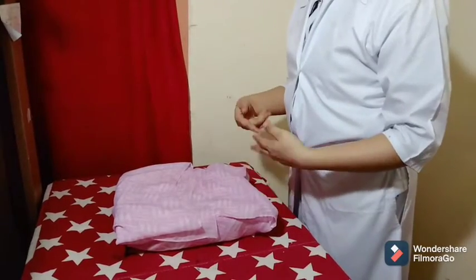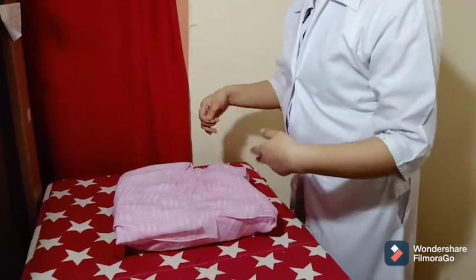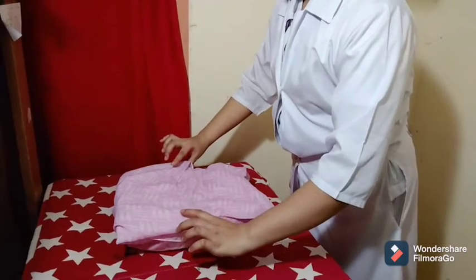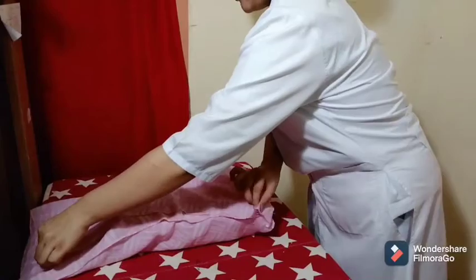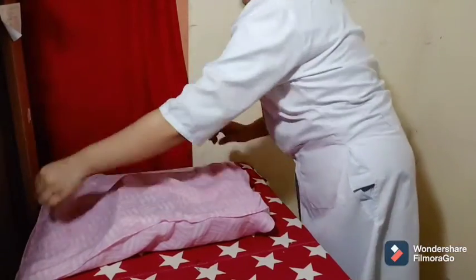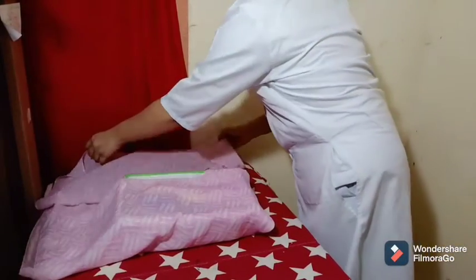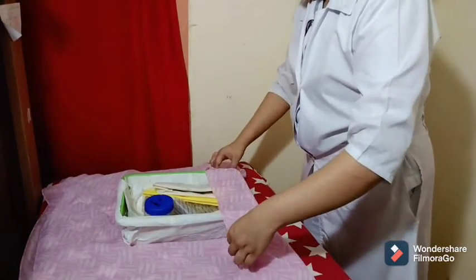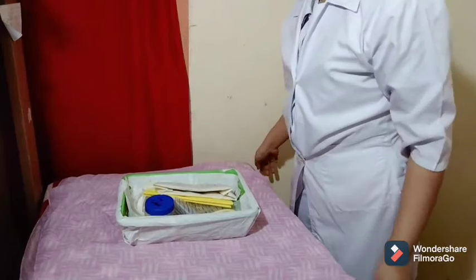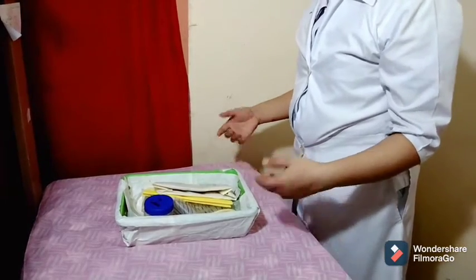So this is the catheter kit, and now I'm going to open it, away from you first, like this, then from the side, another side, and the one nearest to you. This is considered a sterile field. Provide privacy by closing the door and pulling the curtain. The client has the right to be protected from exposure to others.